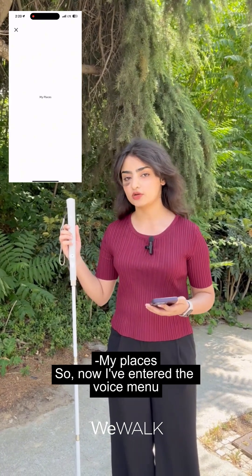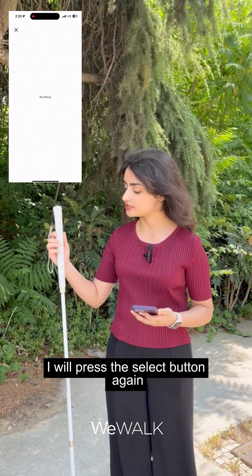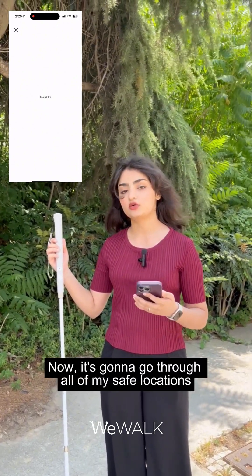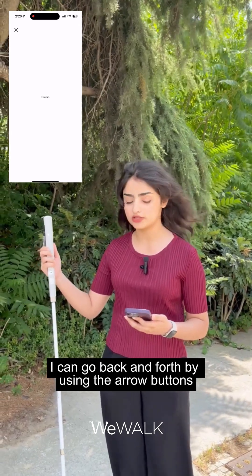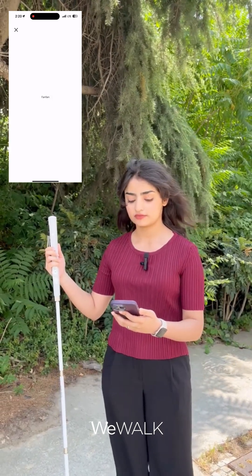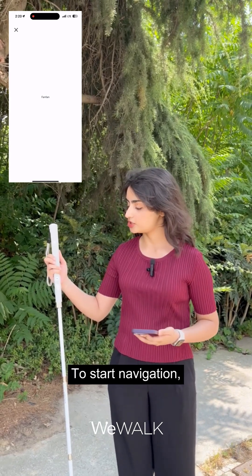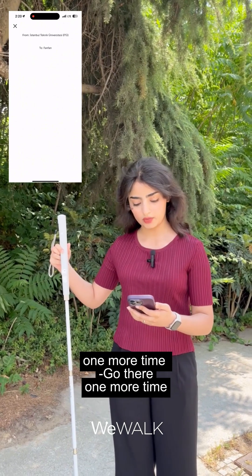Now I've entered the voice menu, and to access my saved locations I will press the select button again. It's going to go through all of my saved locations — I can go back and forth by using the arrow buttons. This is a place I want to navigate to, so to start navigation I will press the third button on the cane one more time.